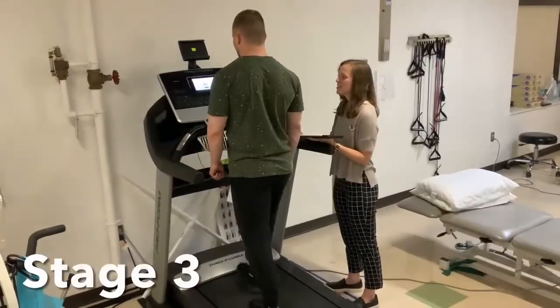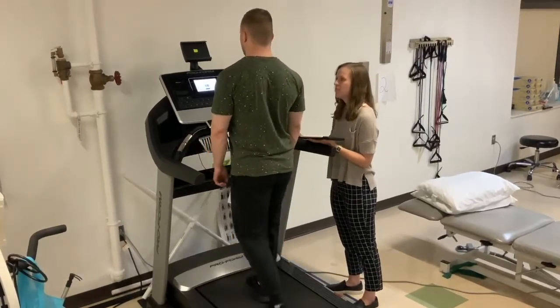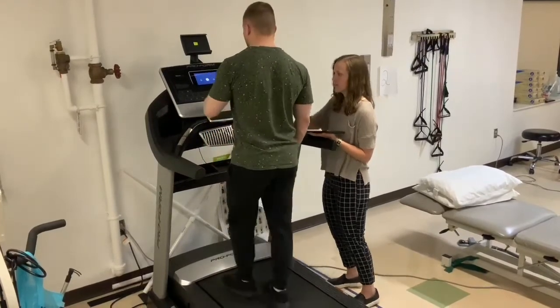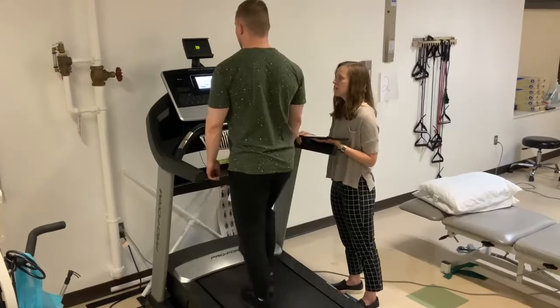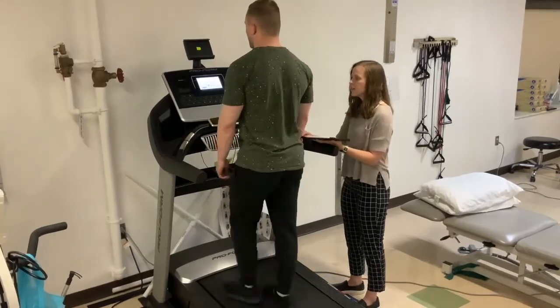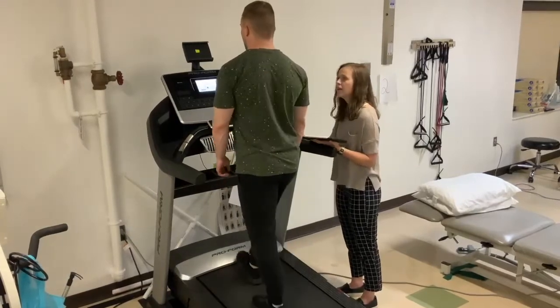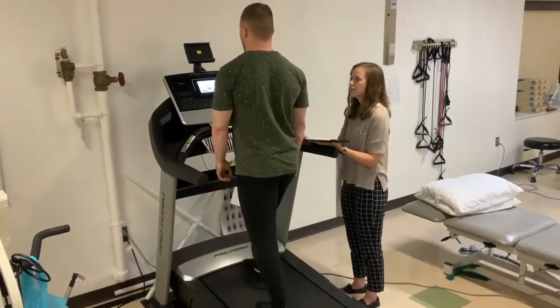All right, so for stage 3, we're at a 3 incline, still at 1.5 speed, and another 2 minutes. Okay, stage 4, we're still at 1.5 speed, but this time we're at a 6 for incline, and another 2 minutes. Stage 5, we're at 9 incline, the speed still remains the same, and still another 2 minutes.